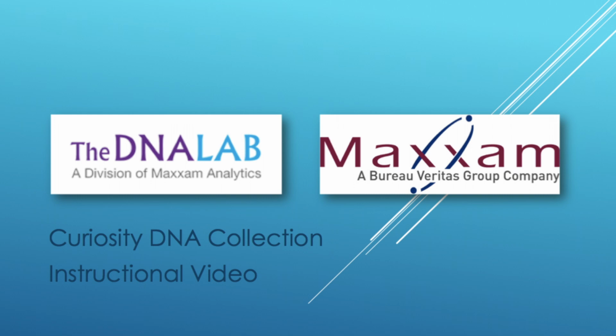Welcome to the DNA Lab's instructional video on DNA sample collection using a curiosity kit. The person whose DNA is being collected is called the donor. Use one sample collection kit per donor. To maintain confidentiality, no name should appear on any samples that you submit.